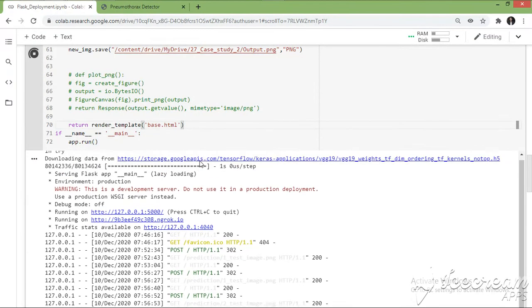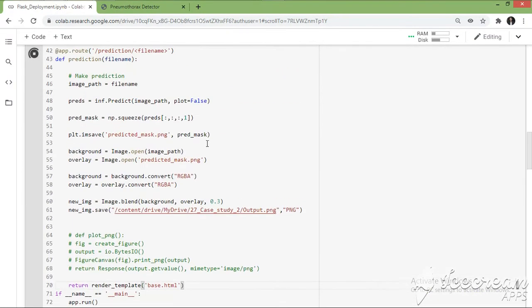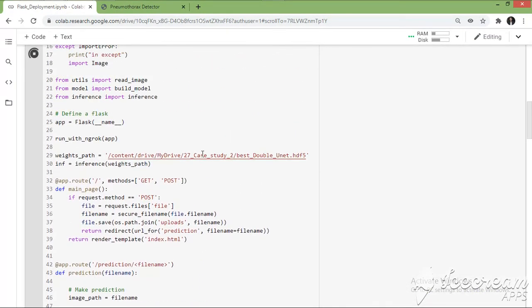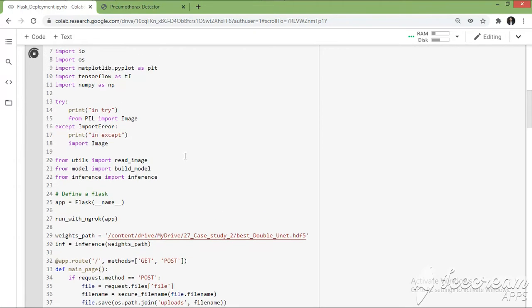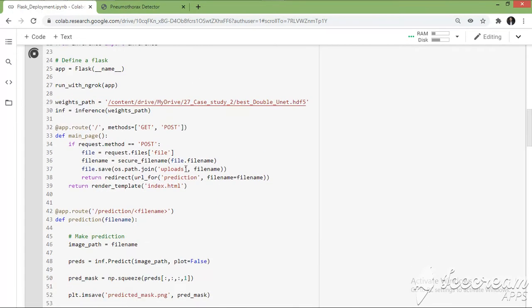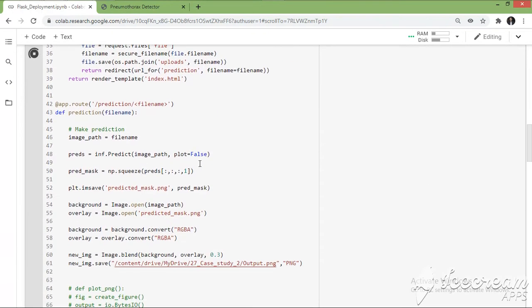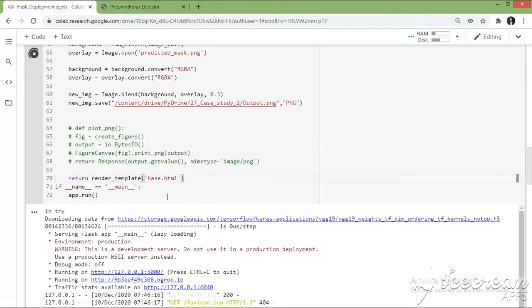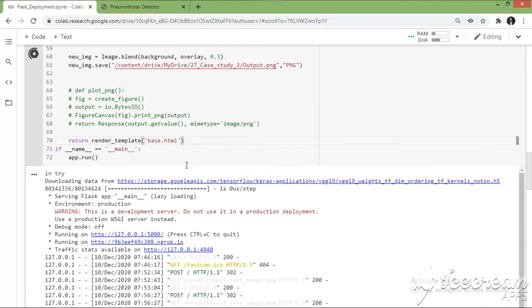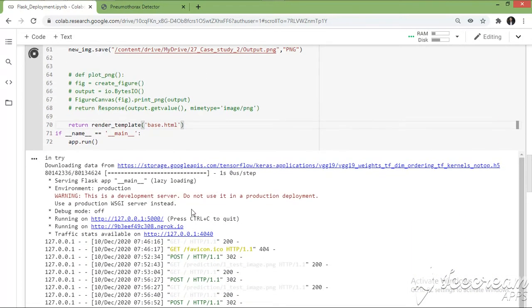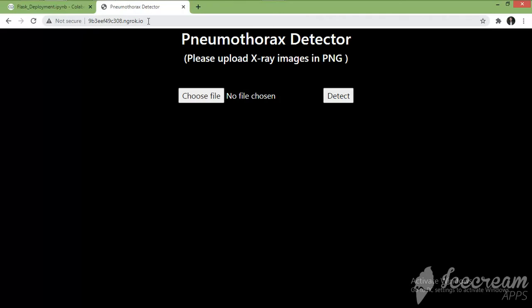For this purpose I have trained a model and deployed it using a Flask environment. This is the port for deploying the model using Flask. I have already executed the cell and you can see the web application is running on this URL, which I have already opened here.